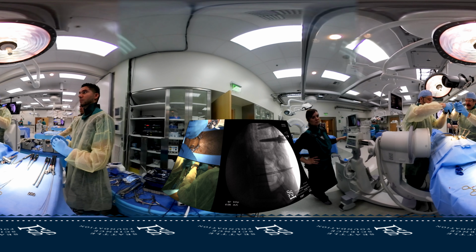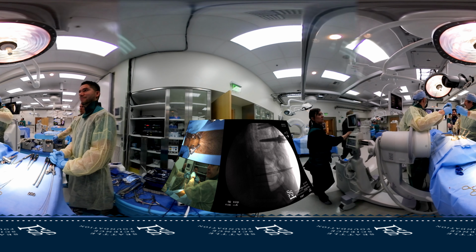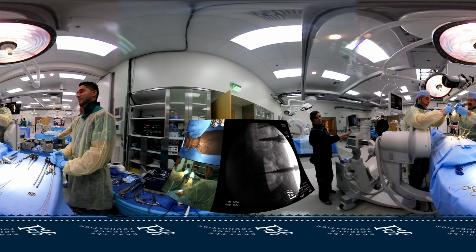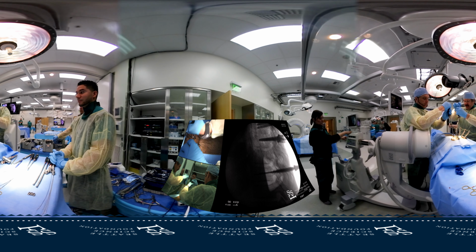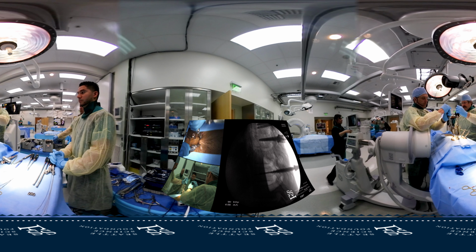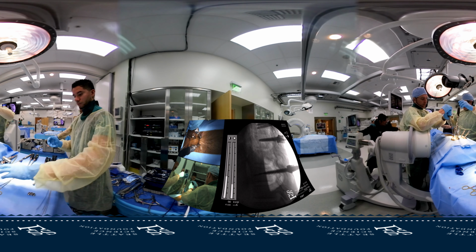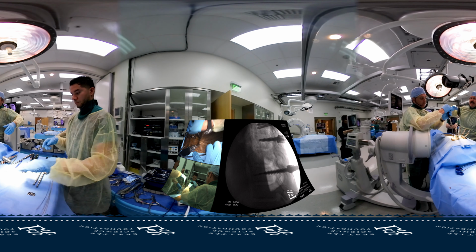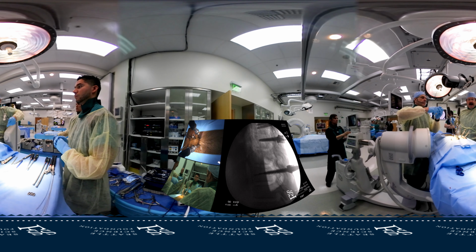And just like doing a hip fracture, as we go in, picture, I'll periodically check to make sure I'm not advancing the wire, that it's not binding up in the screw and advancing through the anterior part of the vertebral body. Picture there. All right. As we get close to fully seated, we'll back out our K-wires before they get jammed up.